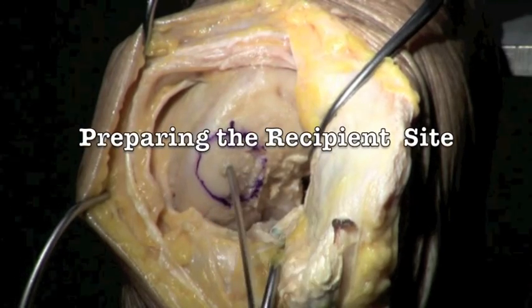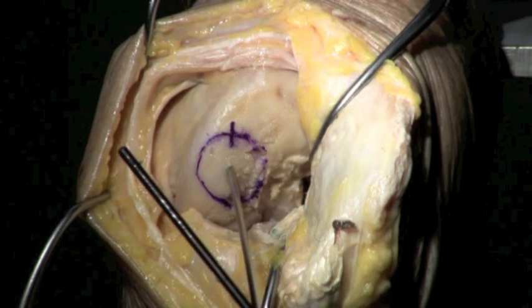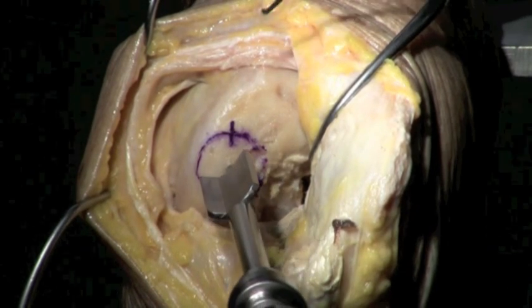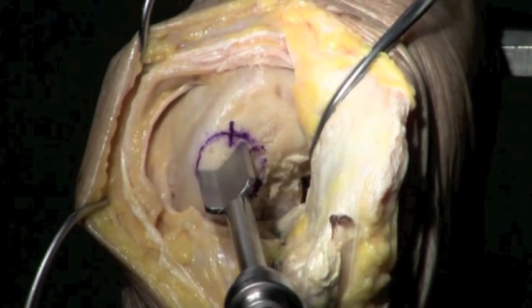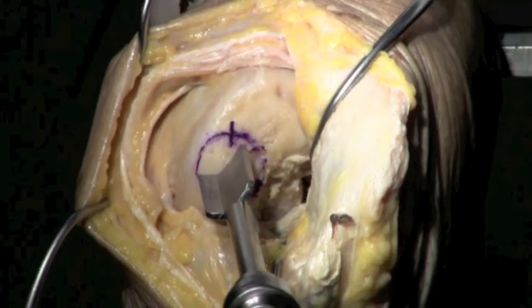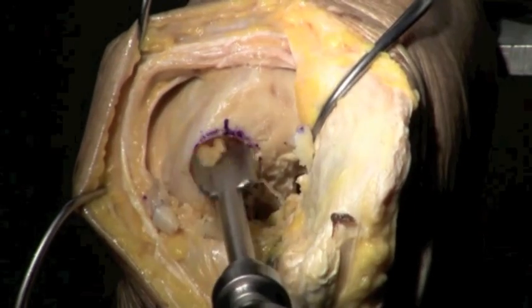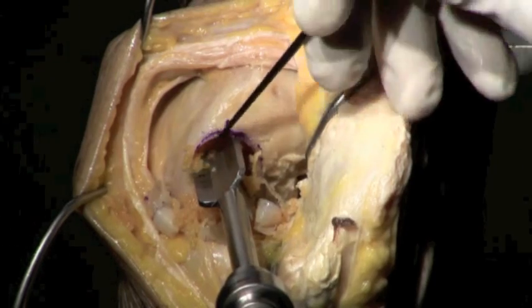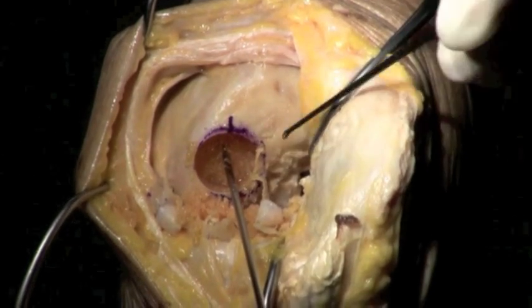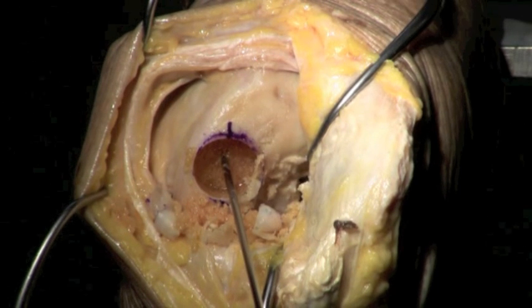So we place the pin directly in the center of the area that we're going to replace, and then there's a special device that we can use that will create the perfect recipient, with all these calibrations on the side, so we can see exactly how deep we're going. So we'll clean that up for the recipient to go in. We'll measure all the quadrants so we know we're going to have a good fit, and we'll go from there.